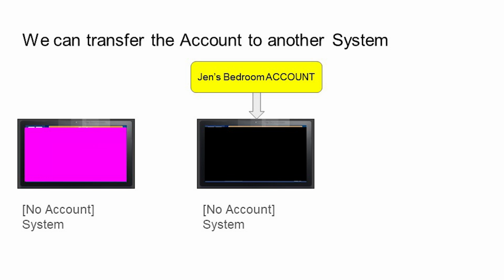If that touchscreen didn't have an account and it were just a system, then everything that had to do with that touchscreen would, in a sense, go away with it once it was defunct.